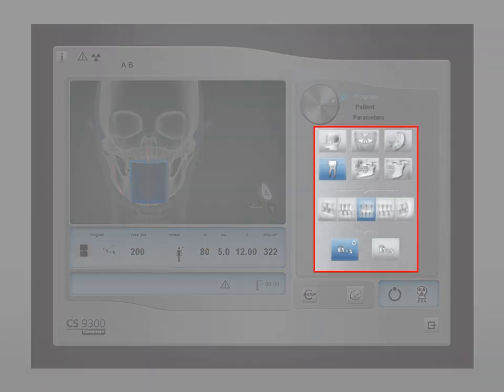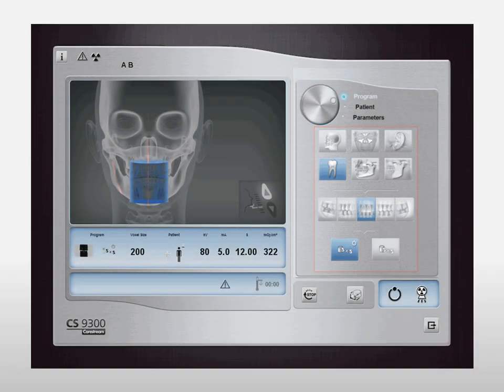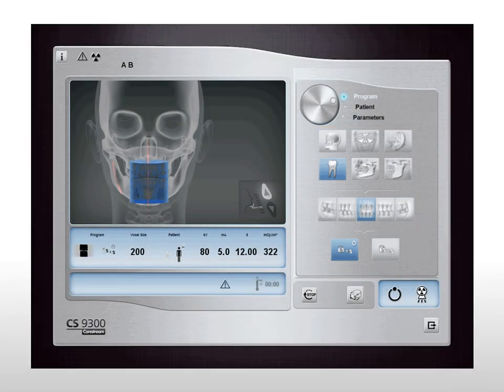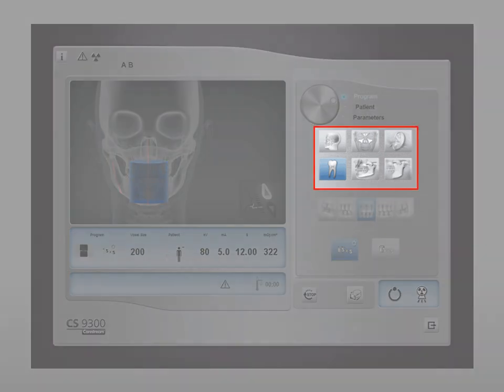Select the image size and quality. See the CS9300 user's guide for an explanation of all radiological exam options. In our first example, we will demonstrate acquisition of an anterior focused field of view volume.